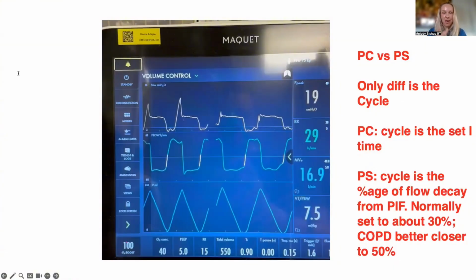When you think about pressure support, you also need to ensure that the cycling of pressure support is matching your patient. So if you have a patient who is breathing faster, with shorter inspirations, they need a higher percent decay. That means the breath is terminating quicker, versus potentially a long and slow inspiratory phase. You can think of a patient that's narcotized, has too much opioids on board. You can think of those patients that you're giving Narcan to. How do they breathe in? Nice, long, big, slow breaths. You can also see this in neuro patients. They might need a lower percent decay, so the inspiration is going to be longer to decay down to that lowered percent.